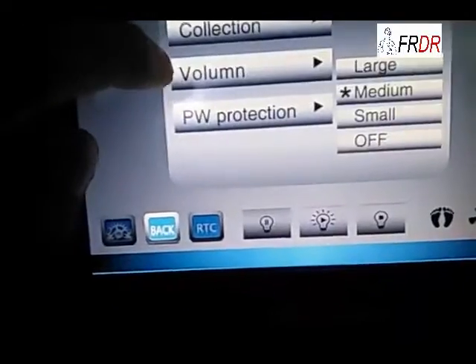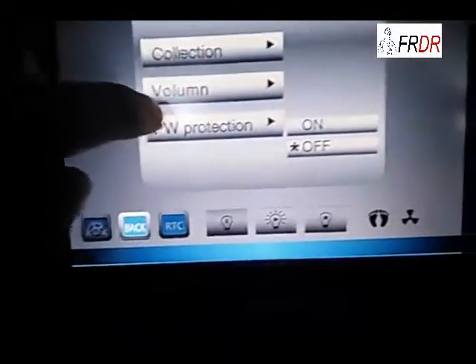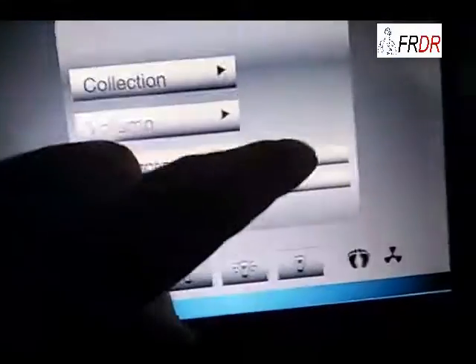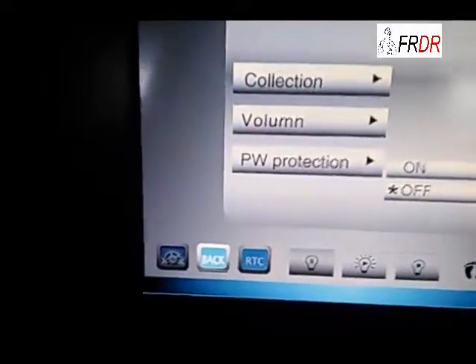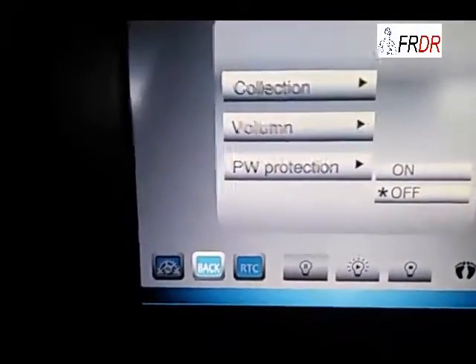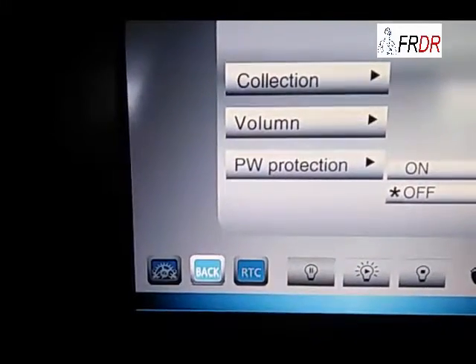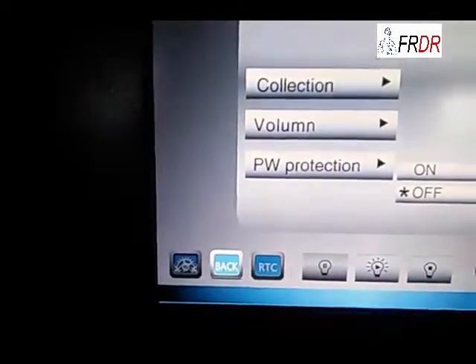This is to adjust the volume, and this is password protection. When we choose on and start the machine, every time we start this machine, the first screen we see is the password screen. We have to input the password to get into normal mode and start the operation.